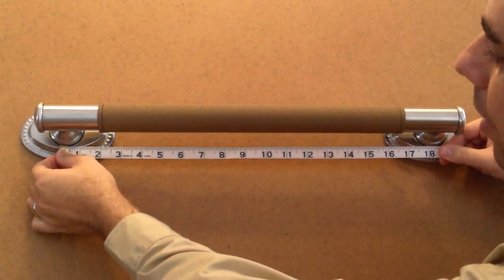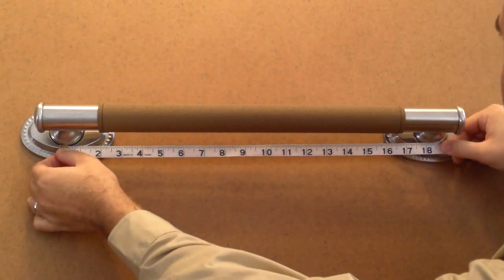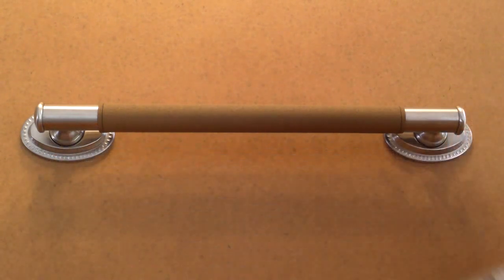In order to do this, we start at the center of one post and measure to the center of the other post. This gives us 18 inches.